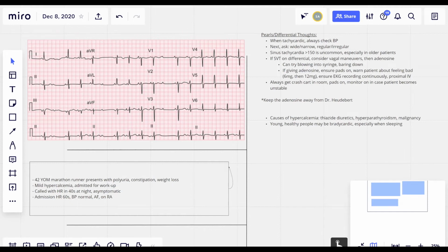It seems like there's almost grouping, at least in the lead 2 tracing. And I'm trying to discern if there's any PR prolongation, and I can't really tell. But the P waves are also not the same throughout the tracing. And then I see that there's also a dropped beat after the third beat in lead 2, and then after the fourth beat.